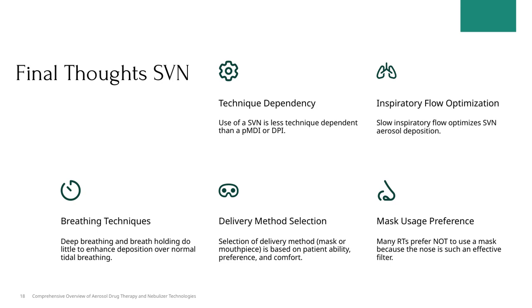So, encouraging patients to breathe normally during nebulizer therapy is usually sufficient. Another important point is that slow inspiratory flow helps to maximize aerosol deposition from the SVN. By controlling how quickly they breathe in, we can improve how much medication actually reaches the lungs.